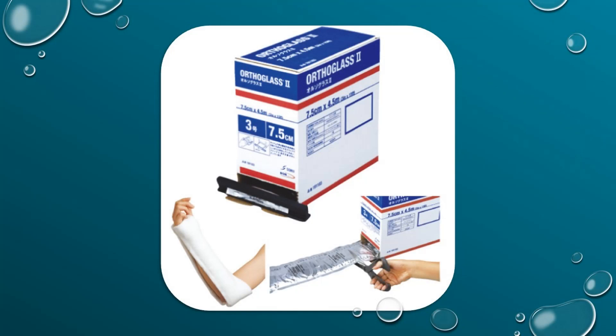Next we have ortho glass. The general technique for splints applies to the application of this material. Select the size and length needed for the extremity. This is important: once you cut the material, make sure you cover the rough edge or stretch the felt over the cut fiberglass, as this can cause damage to the patient's skin if left uncovered. If applying padding to the patient, have a total of two layers using the 50-50 technique. When you are ready to apply the ortho glass, immerse the material in cold water, squeeze the excess water out, and secure the material to the extremity with an ace wrap.